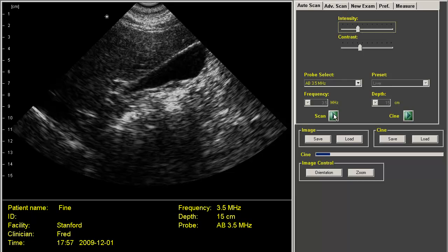The scan freeze button allows you to begin scanning or freeze the scan, but you can also push the button on the probe or the space bar. And the cine button allows you to play any recorded cine loops. There are also controls here for saving and loading both static images and cine images.